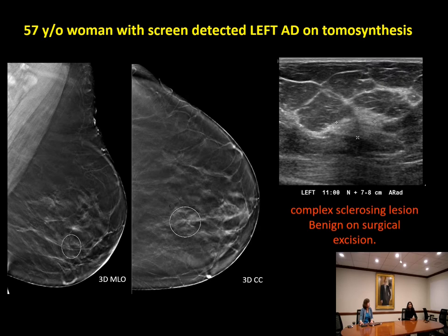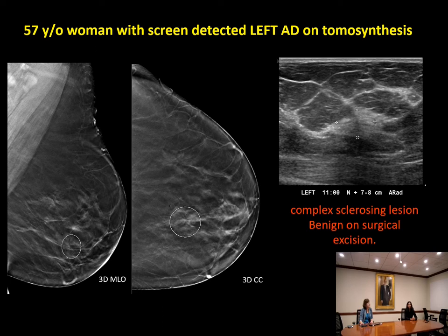Non-mass findings can also be correlates for architectural distortion on mammography. In this case, a 57-year-old woman has screen-detected left architectural distortion. The correlate on ultrasound is a vague focal mixed echogenicity non-mass area. On ultrasound-guided biopsy, this ended up being a complex sclerosing lesion, which was also benign on surgical excision. This is a pretty subtle ultrasound finding — it would certainly be easier to detect with cursors already on the image.